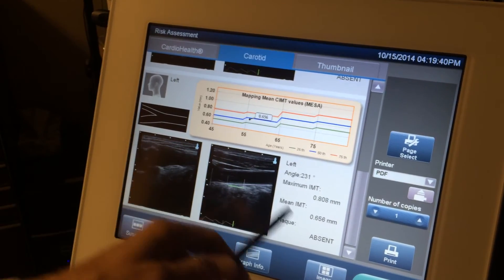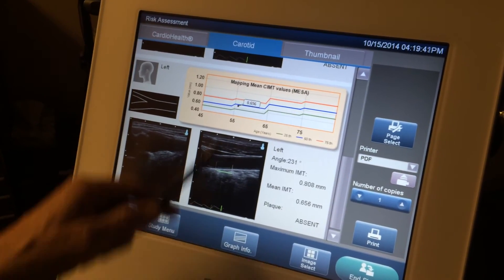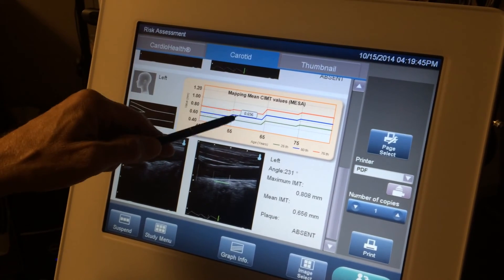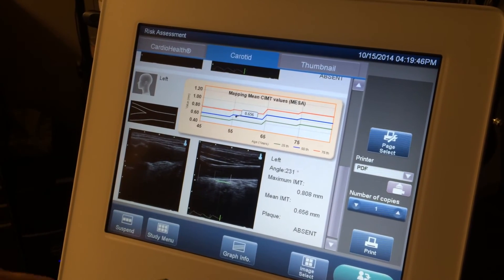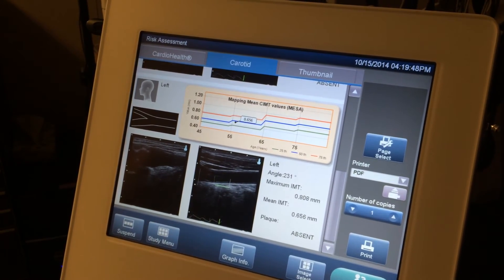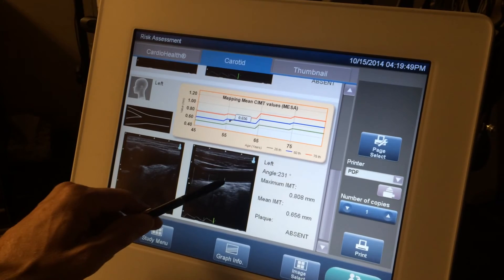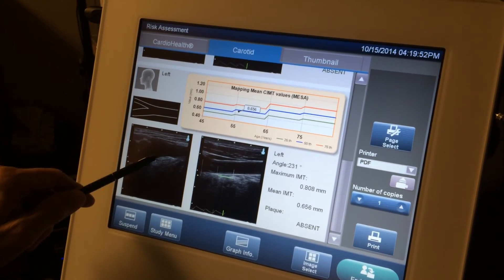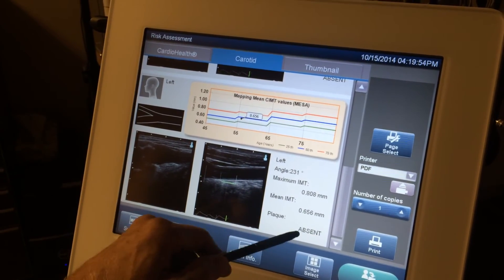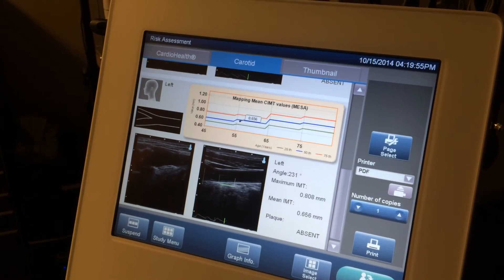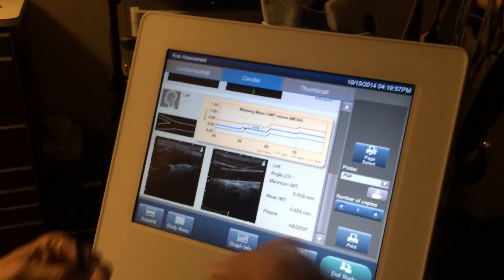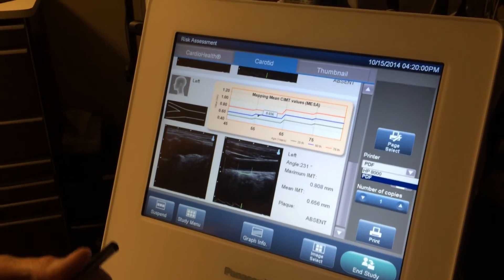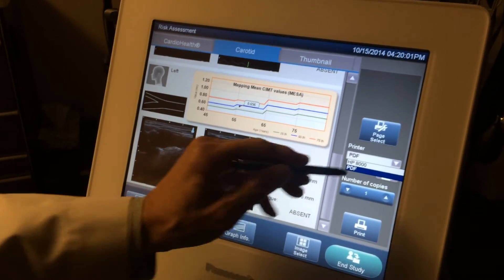And the other side is pretty similar. You're a little bit thicker at 0.656 millimeters, but you're still below the blue line, so you're less than the average thickness. Again, slightly lower risk. And on this side, there was no evidence of any plaque. So that's a good result. As a result of this, I would put you into a lower risk group for heart disease and for stroke.